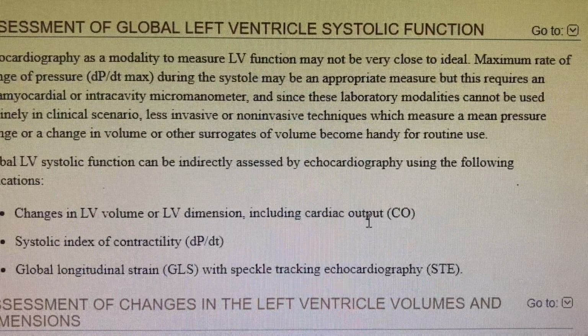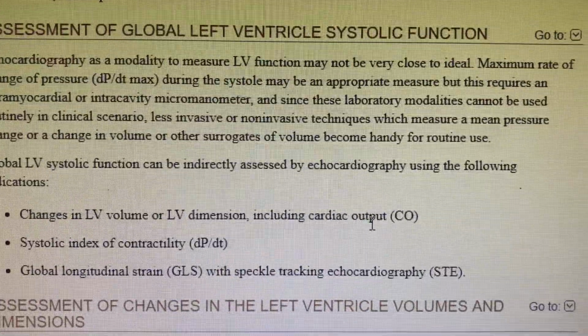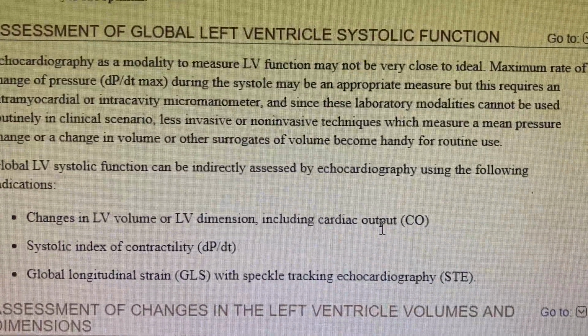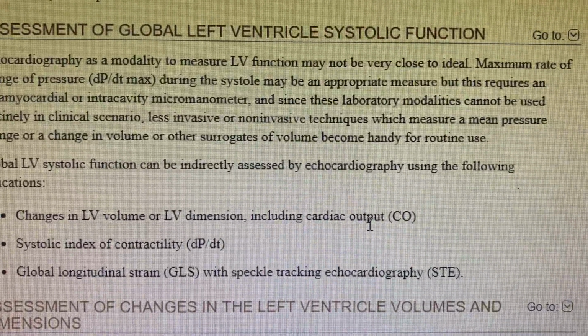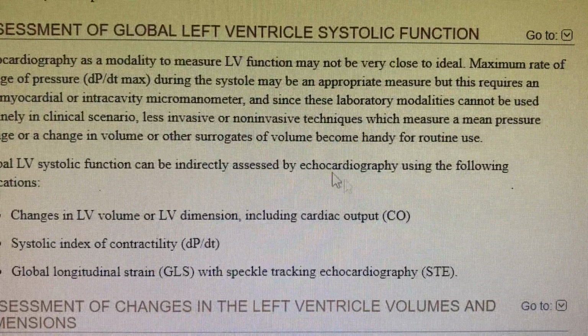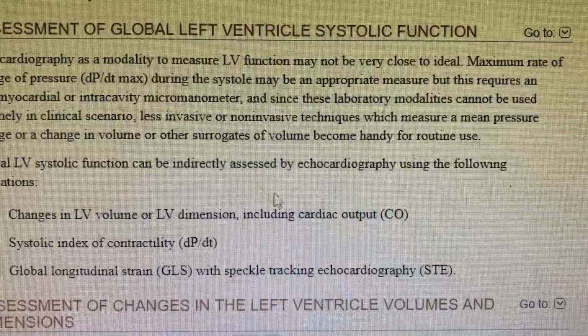Or even cardiac output can also be measured, but these are all very variable. For the measurement's sake we can see how to measure them, but they actually vary very much depending on the hemodynamics, that is preload and afterload, and the heart rate. So we can get very little from them, but the assessment tools we have to discuss.